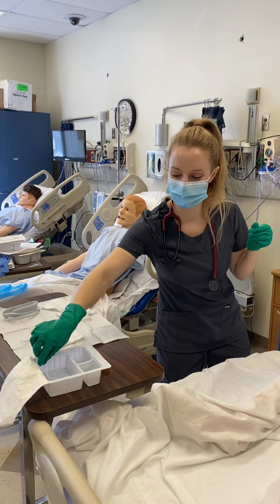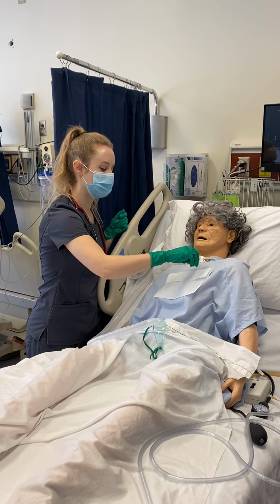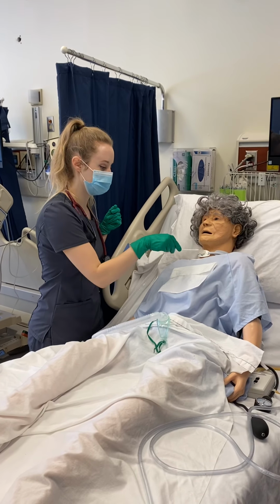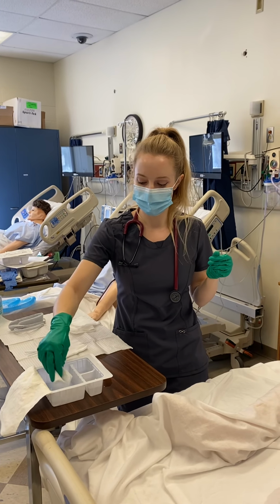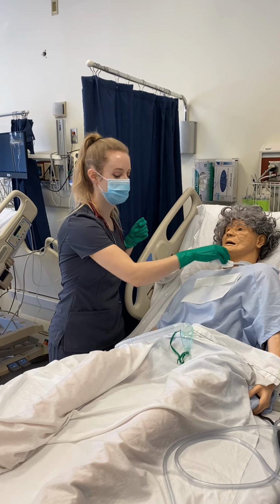And I want to use quite a few of these to really get that area super clean. If there's some crusty secretions, I may want to use hydrogen peroxide to really get those off. And then I could also use gauze dipped in normal saline to clean around the site as well.